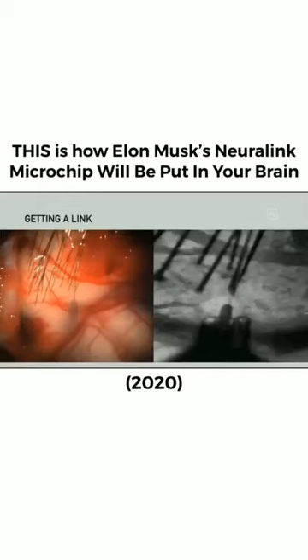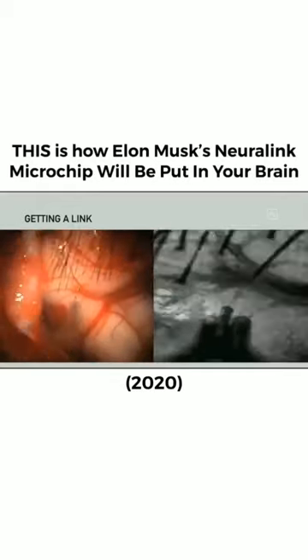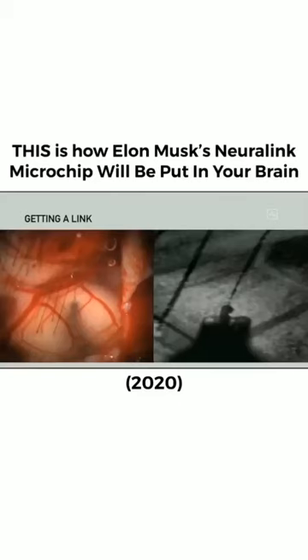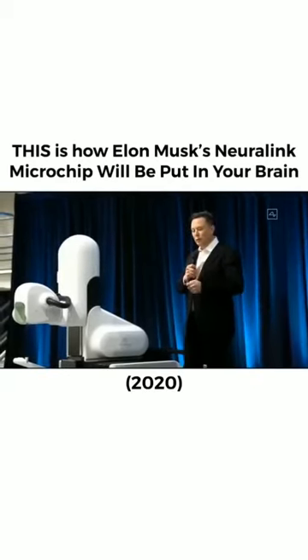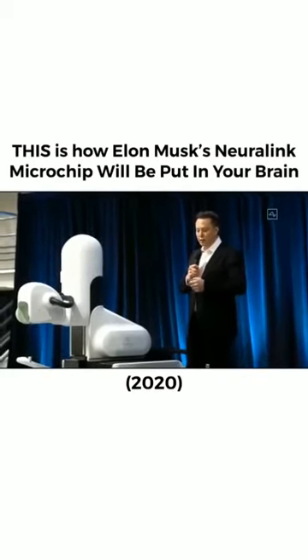And if you look closely, you'll see that it's a little counterintuitive, but if the electrodes are inserted very carefully, there's no bleeding. If you have very tiny electrodes, and they're inserted very carefully, the robot actually images the brain and makes sure to avoid any veins or arteries, so that the electrodes can be inserted with no noticeable damage. So you will have no noticeable neural damage in inserting the Link. Like you sort of think if you stab something with a wire, surely it will bleed, but actually at a really small scale, it does not.